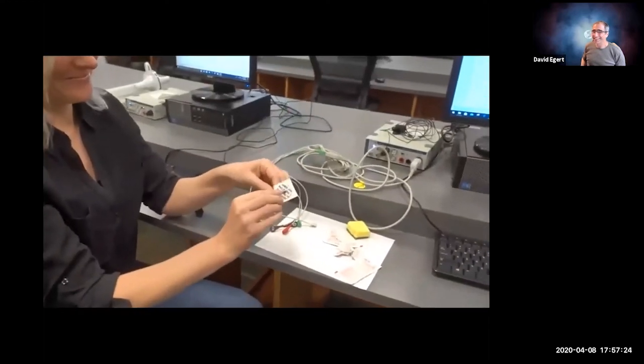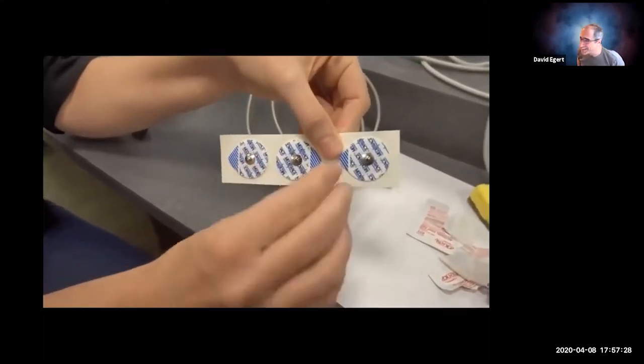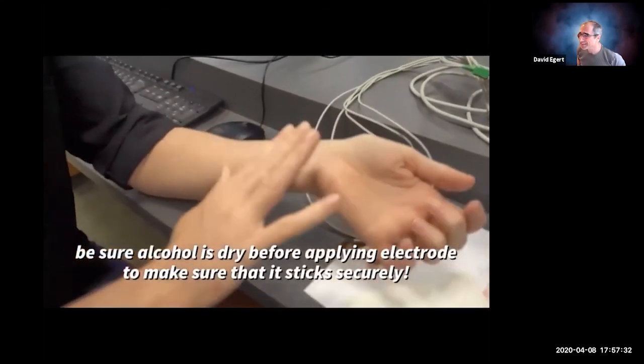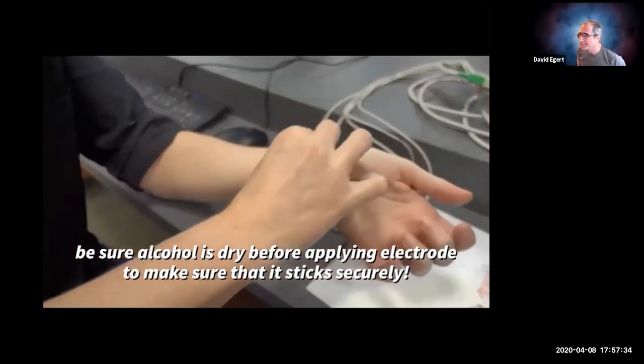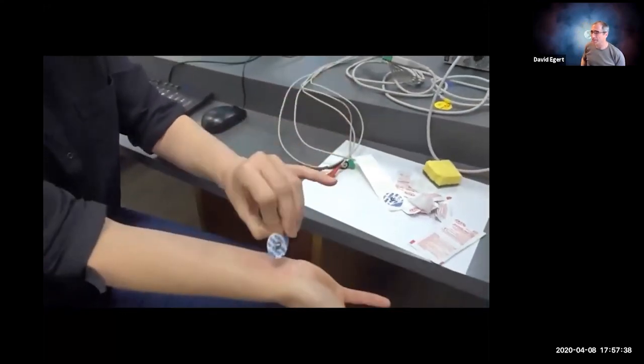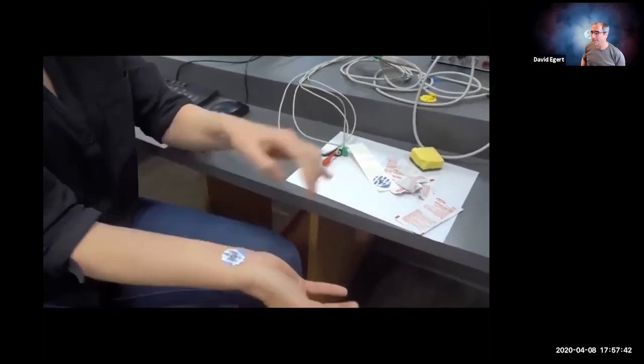All right, so then let's make sure they see that little snappy electrodes. Make sure it's really on there.